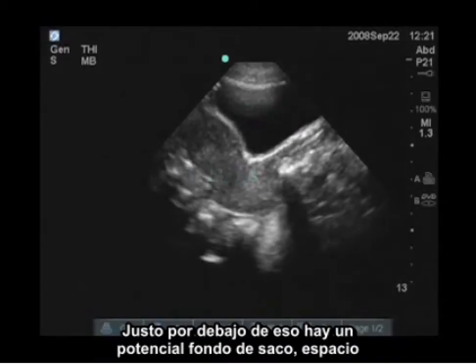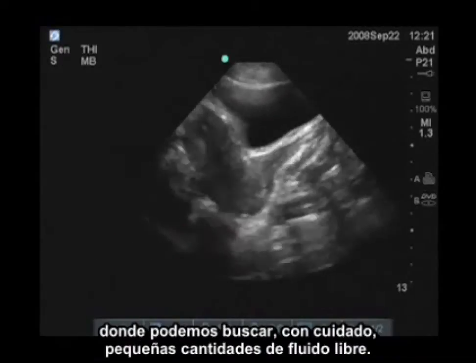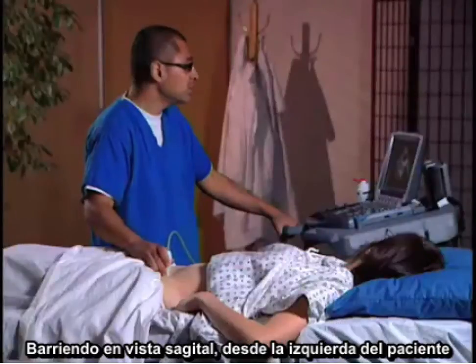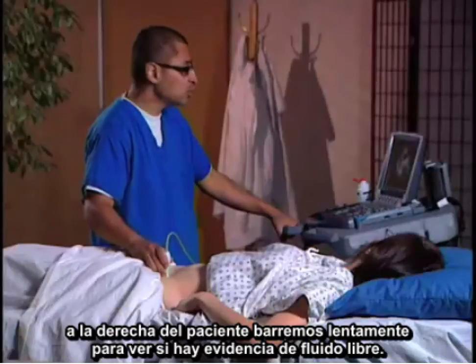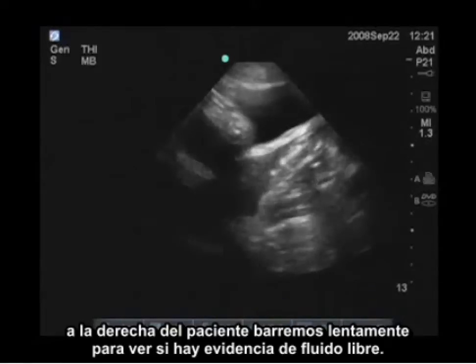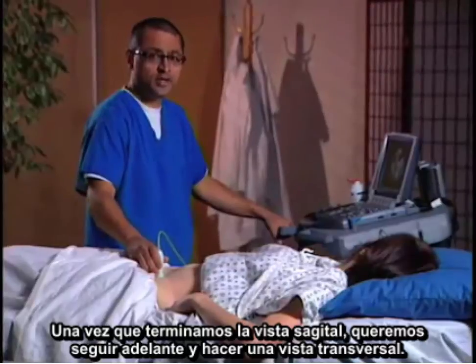And just below that is a potential space, the cul-de-sac, where we can look very carefully for small amounts of free fluid. When we scan this patient in a sagittal view, we go from the patient's left to the patient's right, slowly scanning to see if there's any evidence of free fluid. Once we finish the sagittal view, we want to go ahead and do a transverse view.